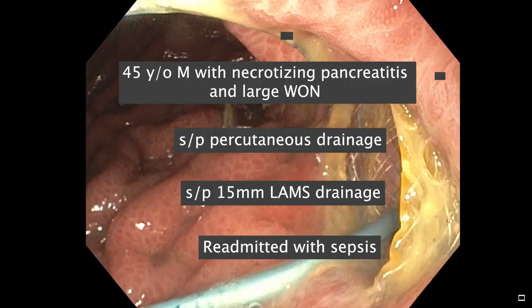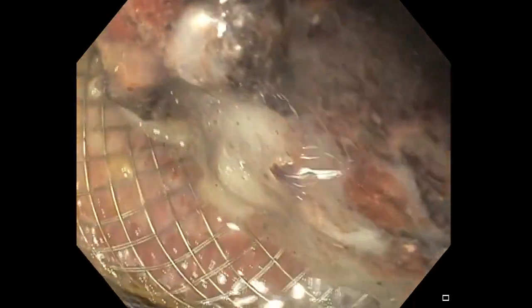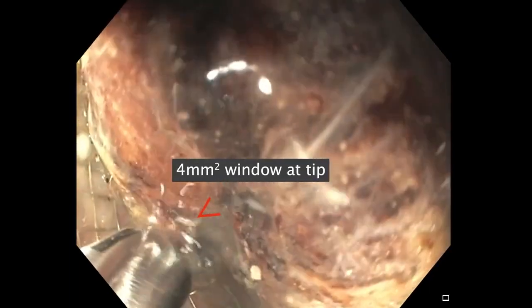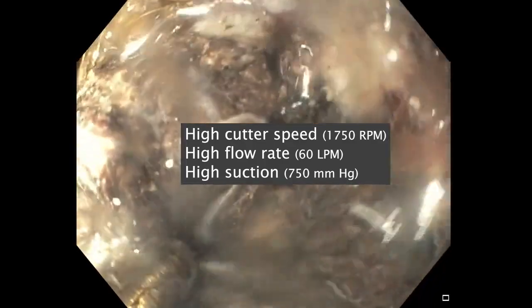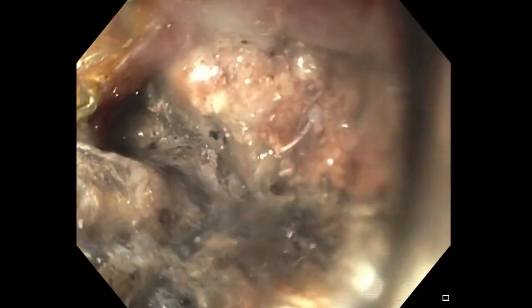This patient had undergone both percutaneous drainage and LAMS drainage for a walled-off necrosis and is readmitted with sepsis. The LAMS is occluded with necrosis. There's pus draining. We insert the EndoRotor through the working channel. You can see the 4 mm window at the tip. For necrosectomy, we use high cutter speed, high flow rate, and high suction. This is an all-in-one device. We can suck, cut, and clear without having to remove the EndoRotor from the cavity.